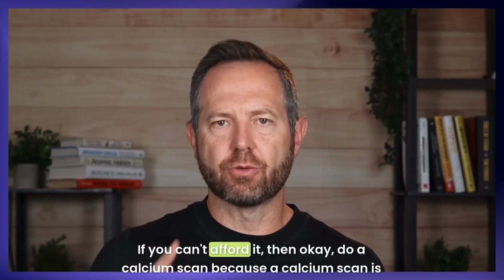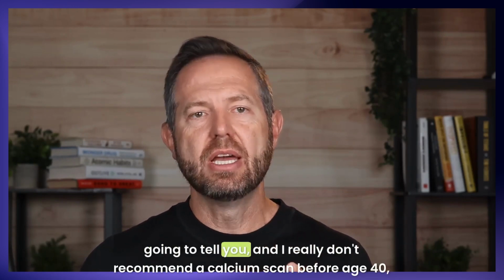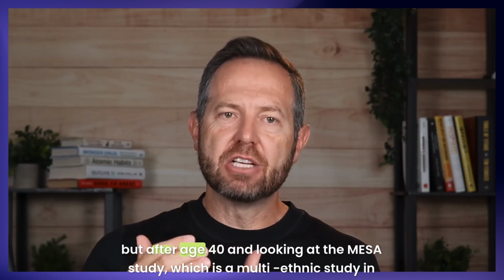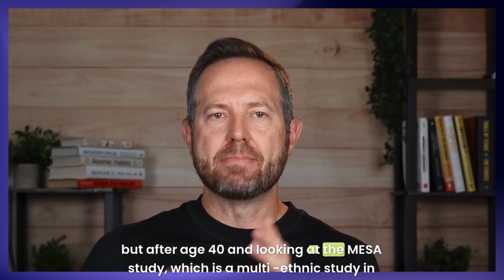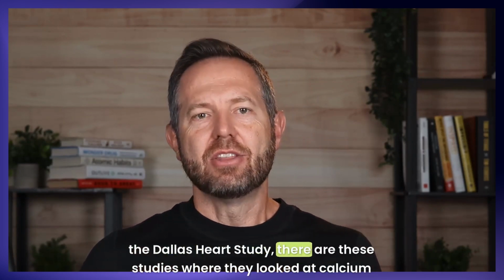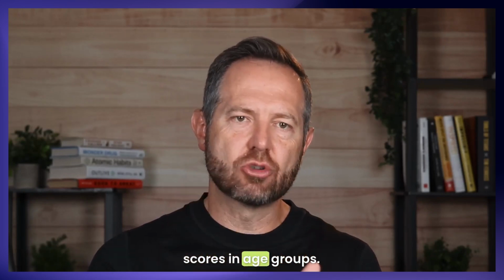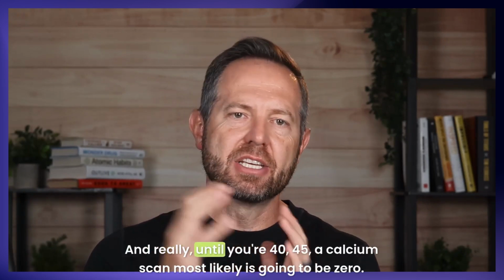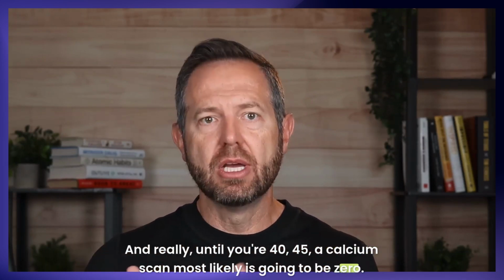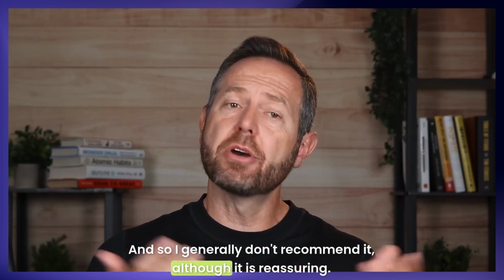If you can't afford it, then okay, do a calcium scan. I really don't recommend a calcium scan before age 40, but after age 40, looking at the MESA study, which is a multi-ethnic study, and the Dallas Heart study, there are these studies where they looked at calcium scores in age groups. And really, until you're 40, 45, a calcium scan most likely is going to be 0. And it's not going to tell you if you have a soft plaque. And so I generally don't recommend it, although it is reassuring.